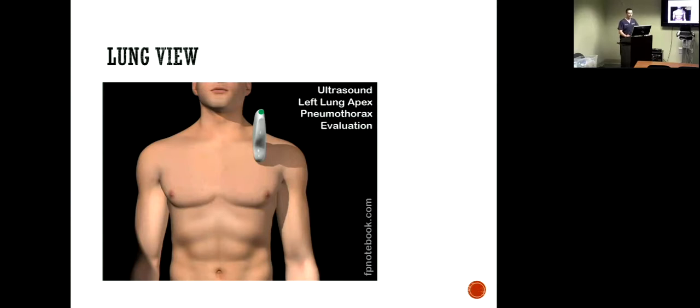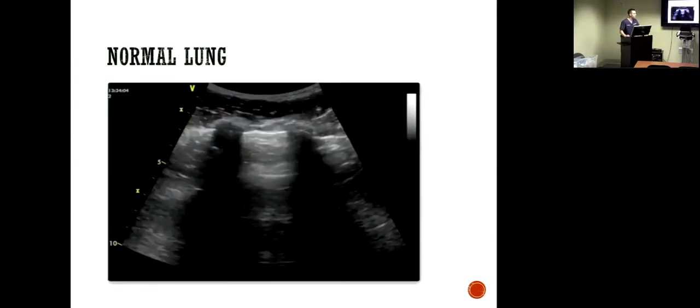As you're driving in, the person starts tanking, but you're like, oh, they're not bleeding anywhere. Maybe this would be the time that you guys are thinking about doing a needle thoracostomy. This would potentially be helpful. This one I think is great for you guys too, because I can't imagine you can hear breath sounds with the sirens and the chaos out there. So if you see lung sliding on both sides, you're pretty confident that you've got good full lungs there.